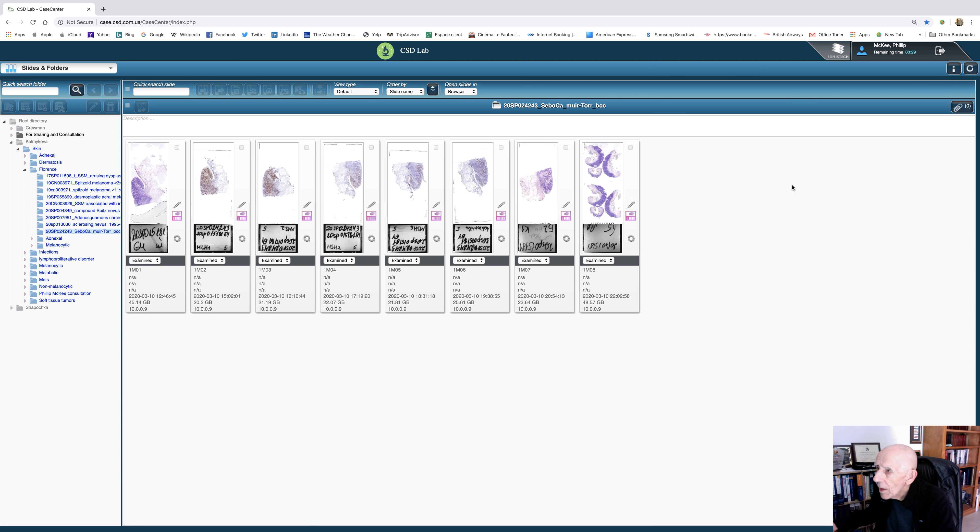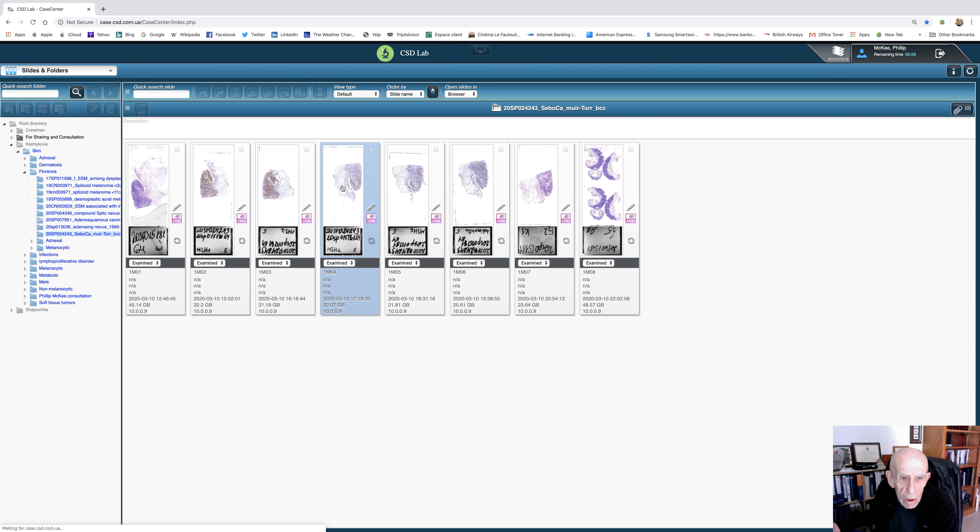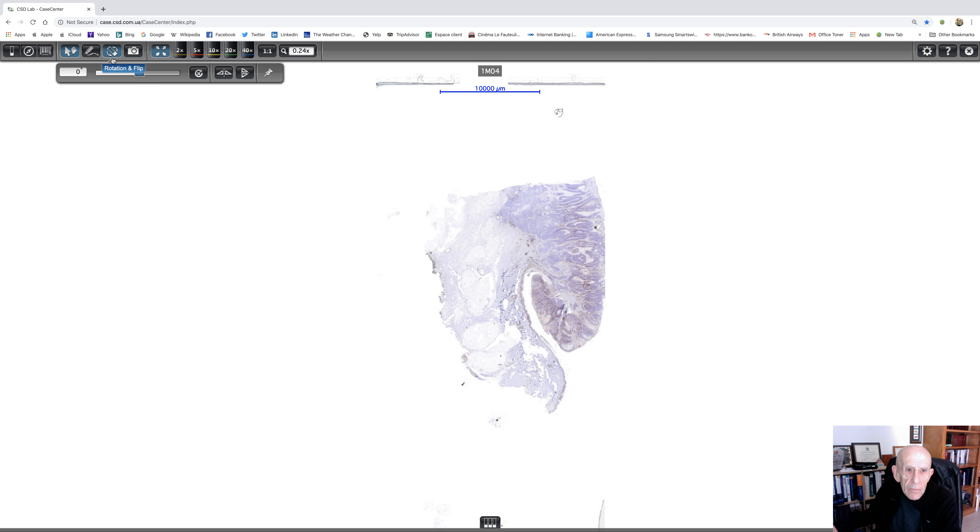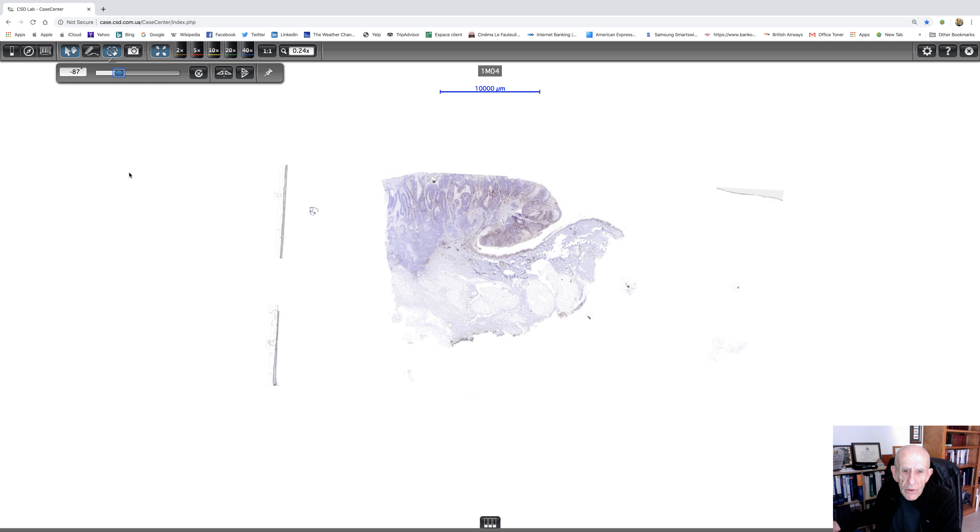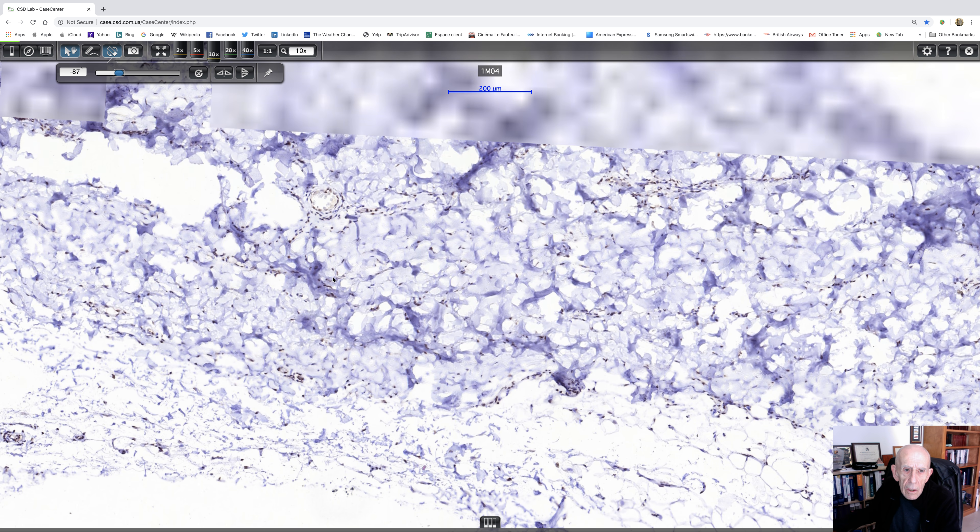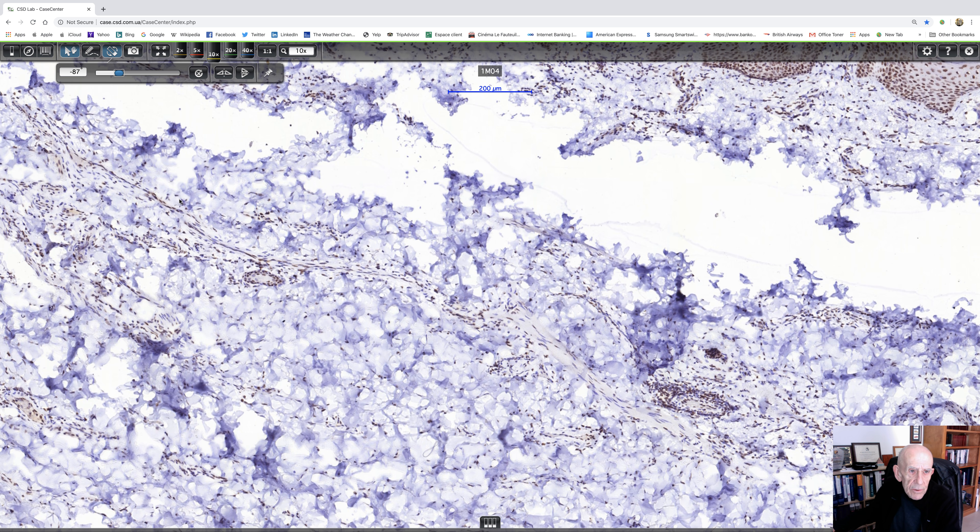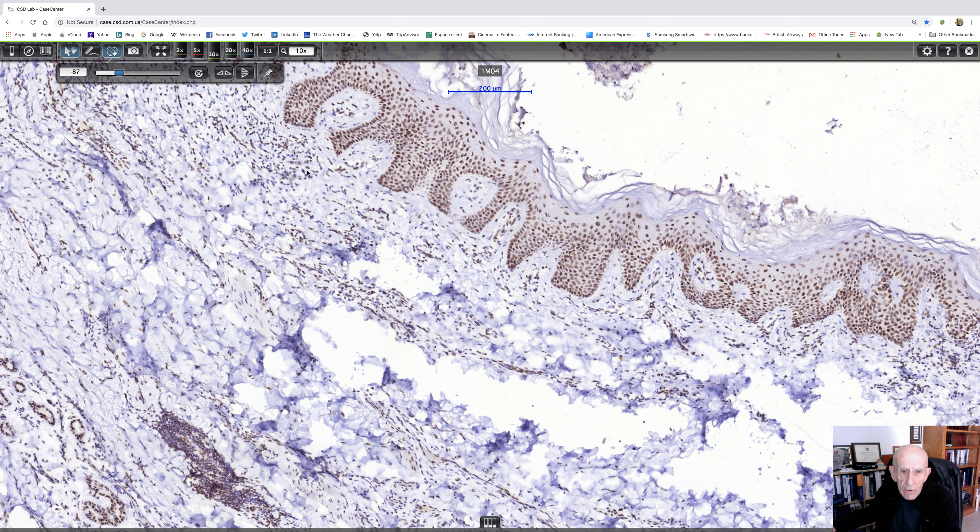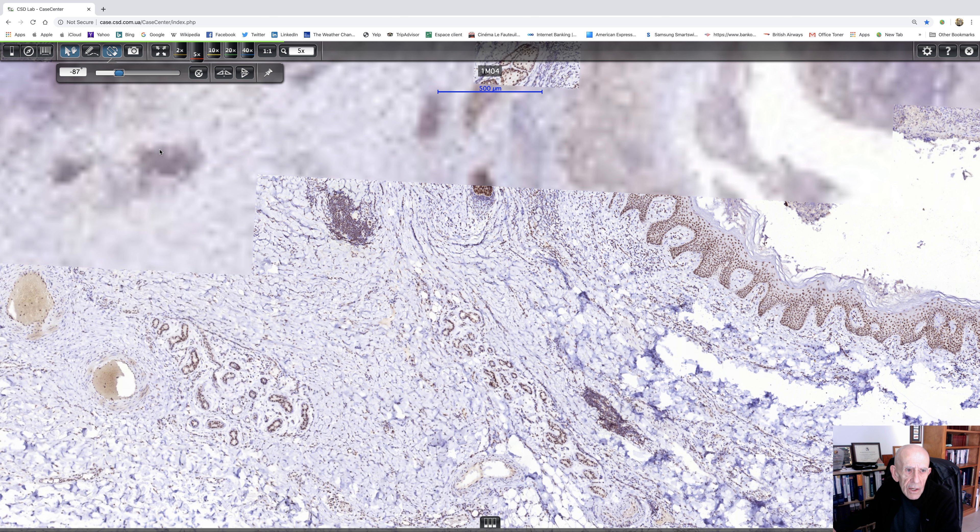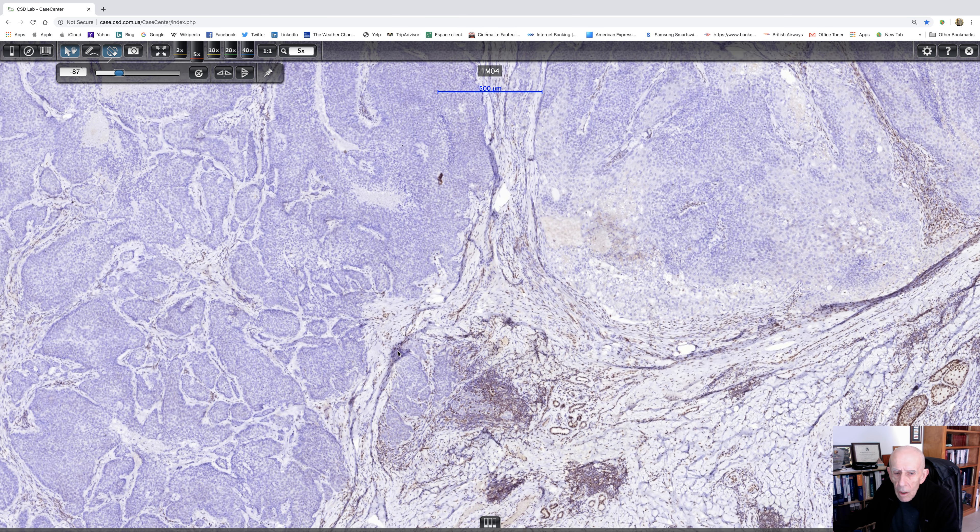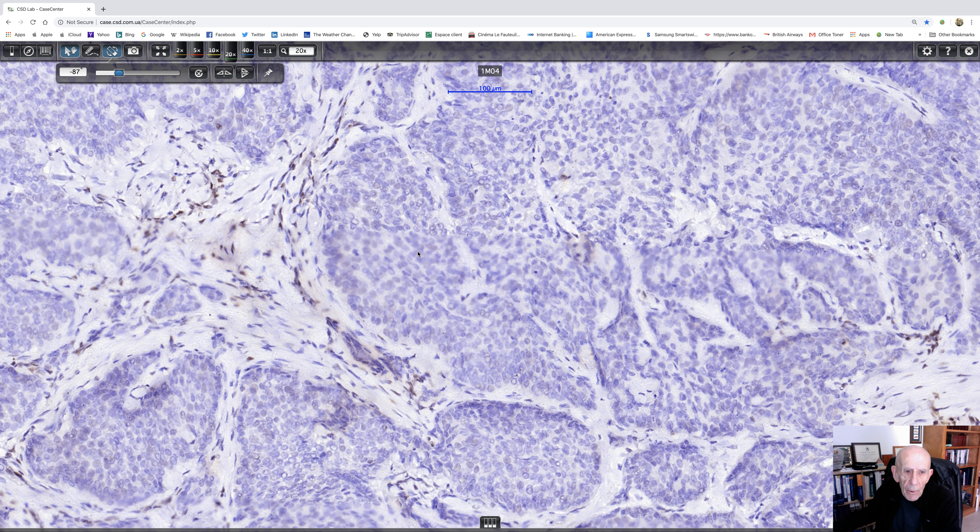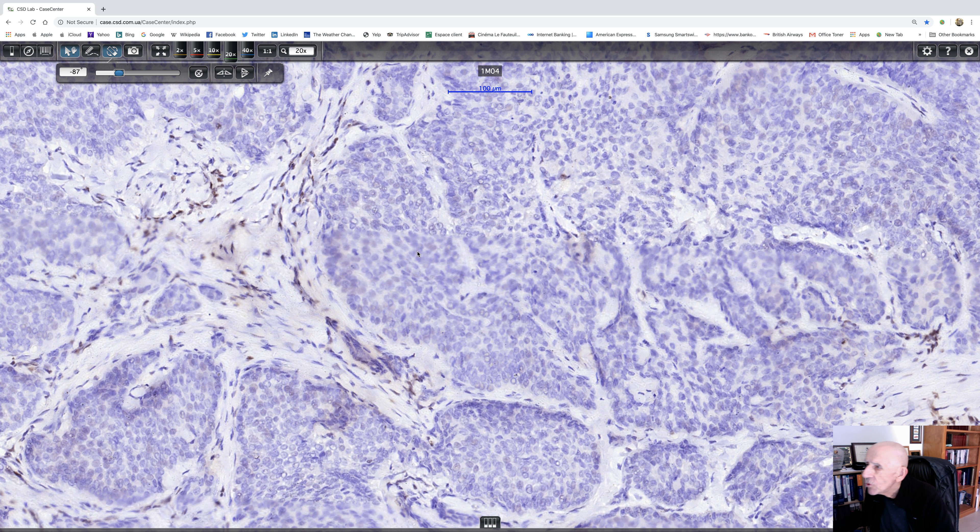Then we'll look... The next one is MSH2. Right. This one is beginning to look as if we're getting somewhere. So this is MSH2. I shouldn't have gone to... There's the positive control in the epidermis. So that's quite useful. I'll go down a power because I'm obviously miles from the tumor. Oh, wow. Well, you can't ask for a more negative than that. That's just wondrously negative. So there's complete loss of MSH2.